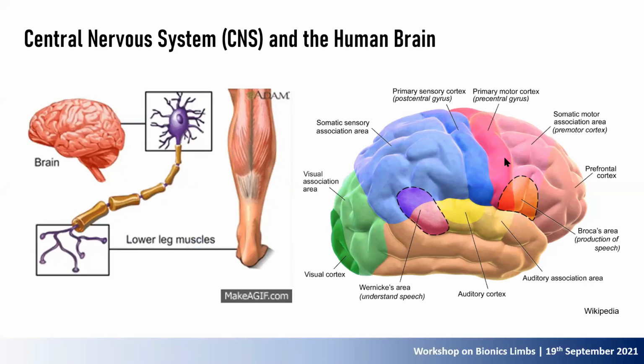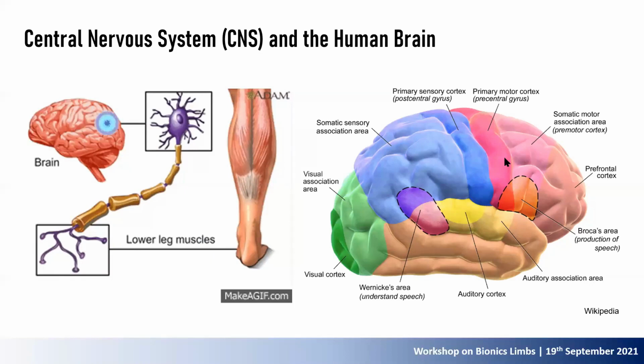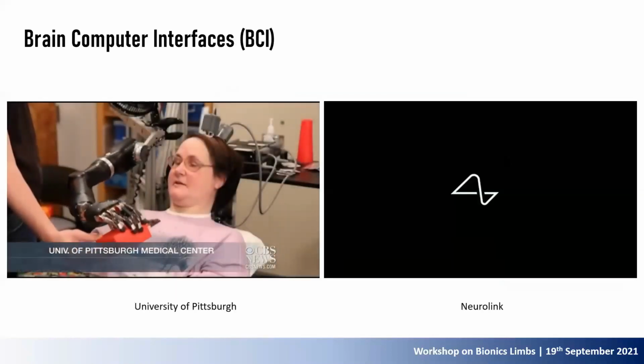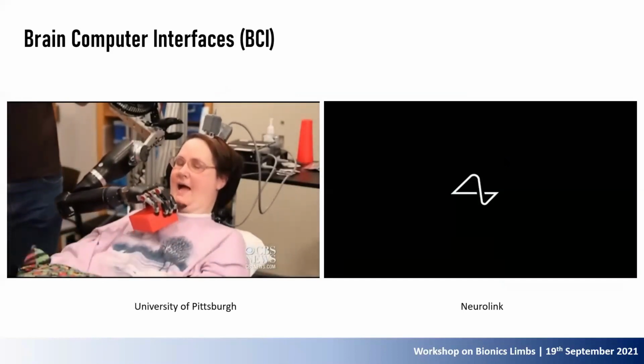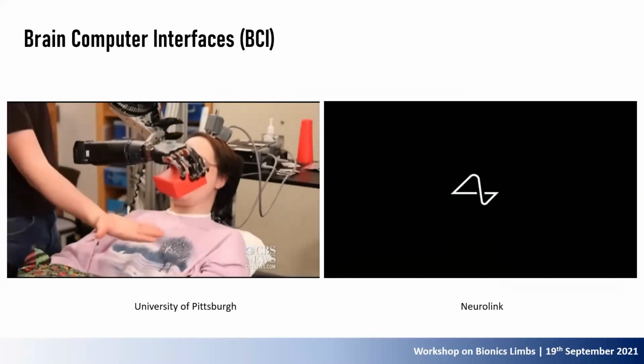As Dr. Sanjay correctly mentioned, if we can tap these impulses somehow using an external device, we can use them for various applications, which include control of bionic devices. So this is where the new term brain-computer interface, or simply BCI, comes in. A brain-computer interface is an interface which captures the brain signals using external devices and uses those signals to control an external device or an application.